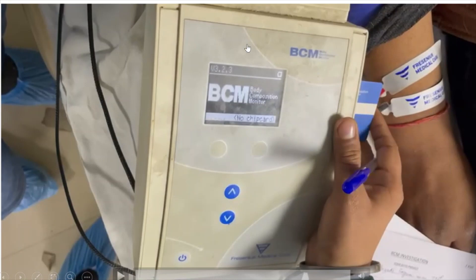To summarize: insert the card, attach the electrodes to the upper and lower parts of the body, then enter the parameters — age, sex, body weight, height, systolic BP, diastolic BP, and planned ultrafiltrate. The machine then forms a graph and gives the patient's over-hydration or under-hydration status. Additionally, adipose tissue mass, lean tissue mass, extracellular mass, intracellular water, and total body water are all provided. This is all about the Body Composition Monitor.